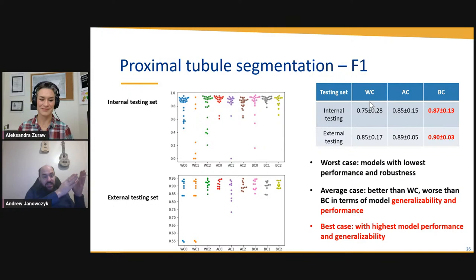And then you start to realize that the worst case, average case, and best case exist on a continuous spectrum. And when you randomly sample, you have no idea where you are in that spectrum. So you're going to spend all this time to train classifiers, and you may be close to that worst case and not even realize it. Here, I think we've quantitatively shown that you can use Cohort Finder and always guarantee you end up in the best case in 15 seconds of computation time.